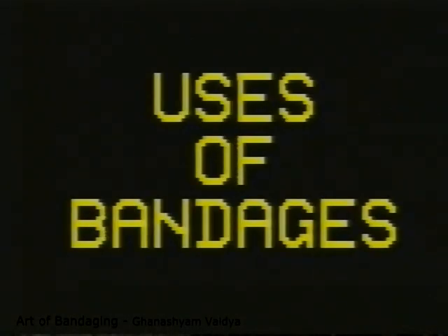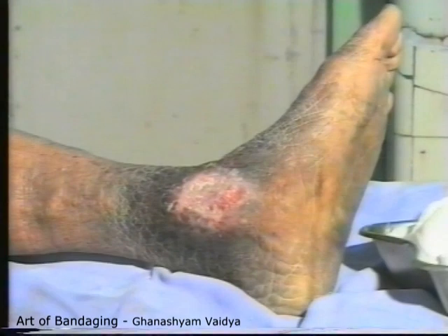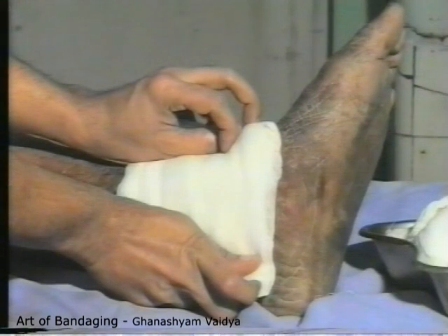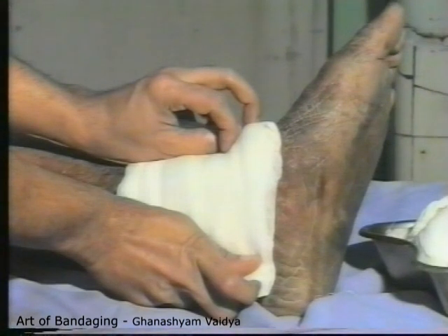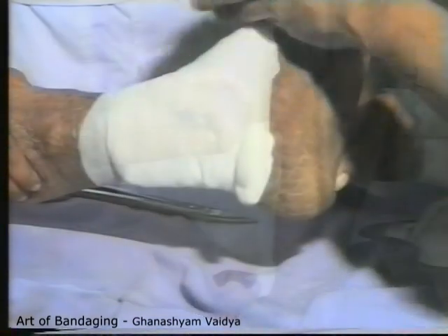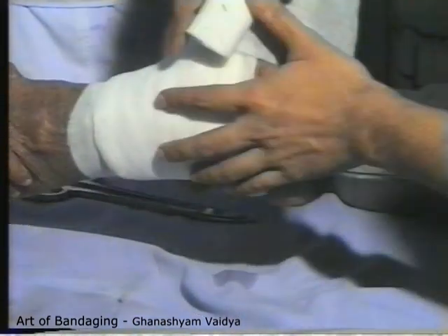Let us first study the various uses of bandages. The most common use of a bandage is to hold dressings in position. Note this ulcer on the medial aspect of left ankle, covered with gauze and gamgee dressing which I am holding with my hand. Now watch the bandage as it covers and supports the dressing, holding it in place.